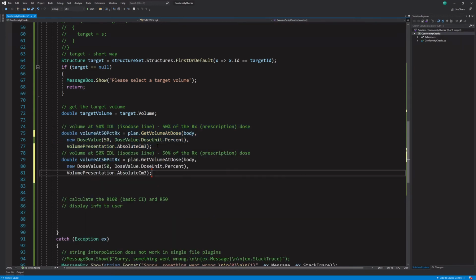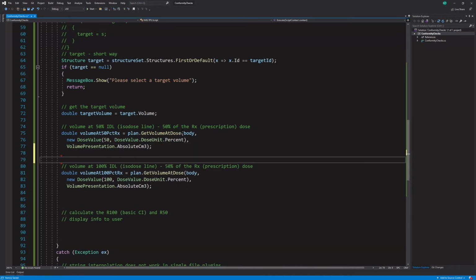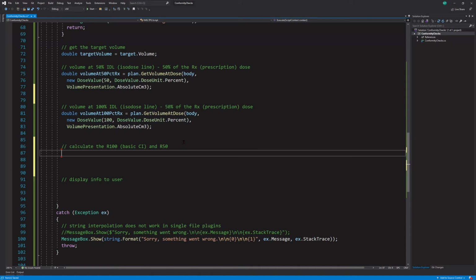And then we also want, well, eventually we'll need the 100, right, for the CI. So the volume at 100. So let's say, well, that'll work. Okay, and then let's change this from 50 to 100. Okay, so now let's add some space just for readability. All right, so now we've got those values. So now let's calculate them.